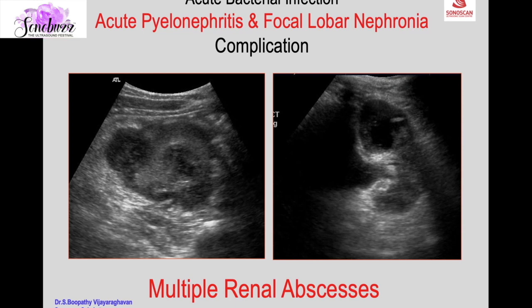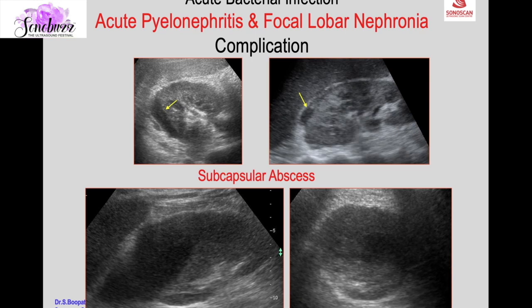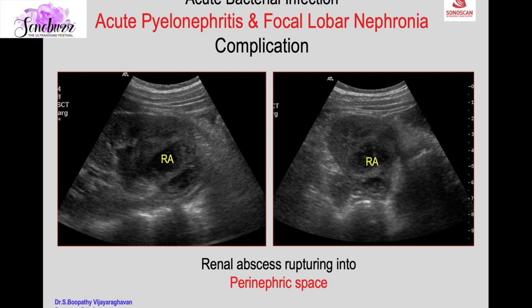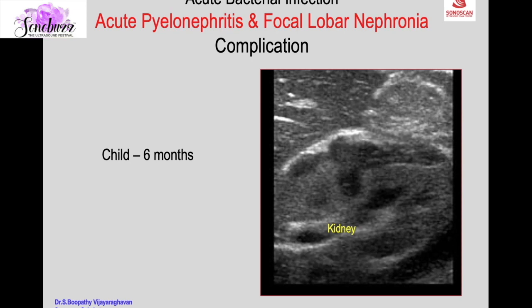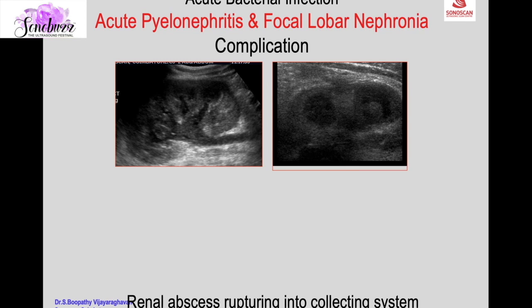Multiple renal abscesses may be seen in the parenchyma. A complication is subcapsular abscess, seen on the periphery in the coronal scan, which may be large, compressing the rest of the parenchyma, due to rupture of the renal abscess. Renal abscess can rupture into the perinephric space producing a perinephric abscess. In a six-month-old child, high-frequency scan clearly shows a small renal abscess which has ruptured and produced a biconcave perinephric abscess. The renal abscess can also rupture into the collecting system, with pus visible in the collecting system.